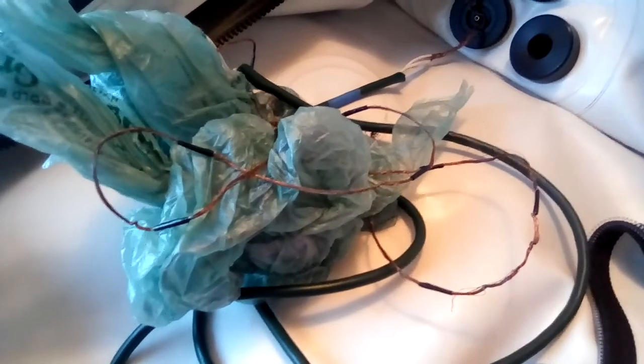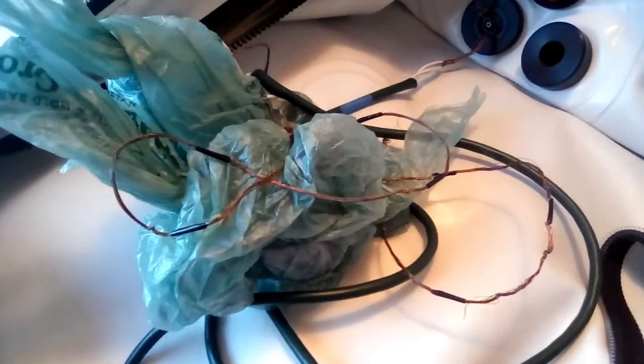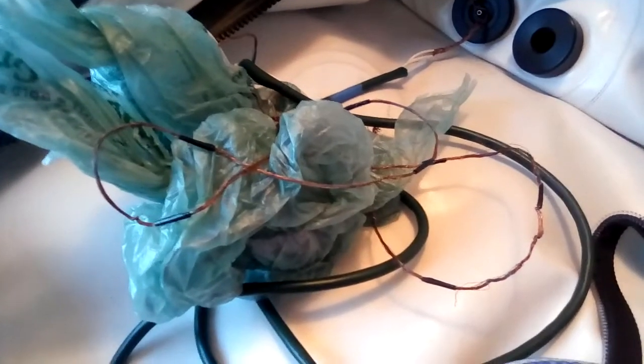So what I do is I just have all this cord in there. I wait for the chamber to fully inflate, and that's when I eventually hook up that end to it. But actually I do that last, because the first thing I do, see, it's pretty tight on there, so I probably shouldn't even remove it. First thing I do is I take these bags. I have those 3 separate wires. They're all made into bare wires for a pretty long distance, enough to wrap them around my head. At least one of them wraps around my head about 2-3 times.